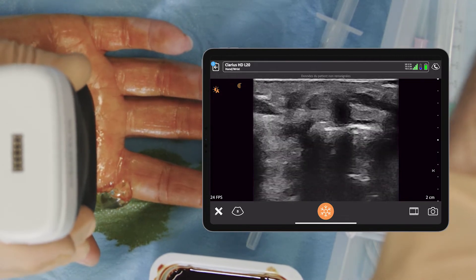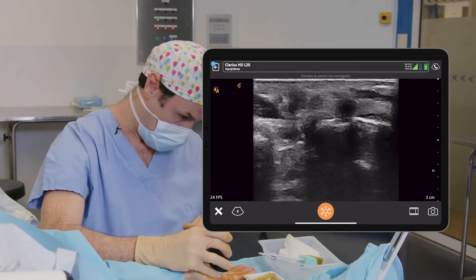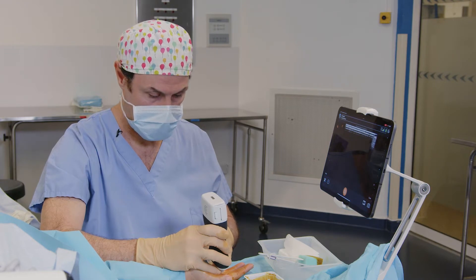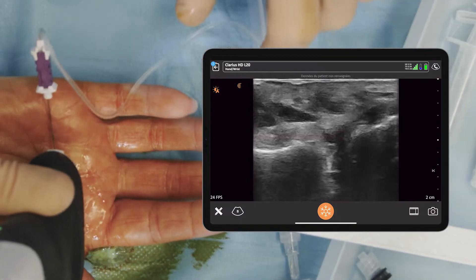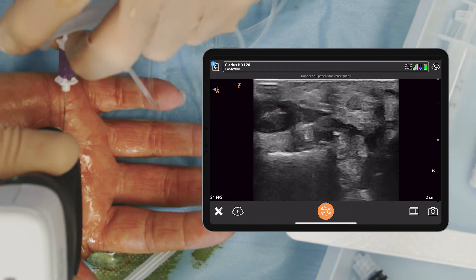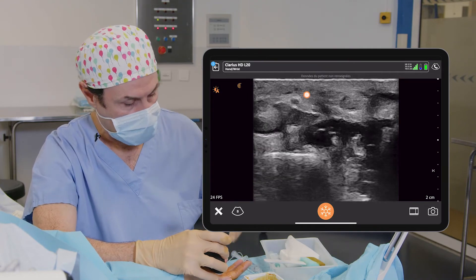We see here the flexor tendons and the tumor is here. We do skin local anesthesia with a 30 gauge needle. Here we see the needle and we begin our injection. We see the nerve and the artery here, just on the left of the tendon.